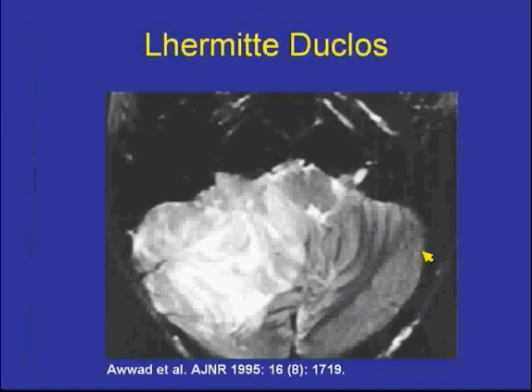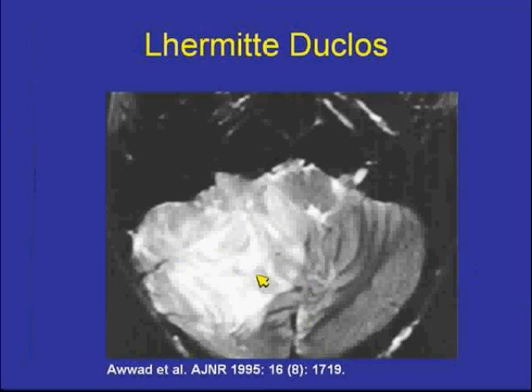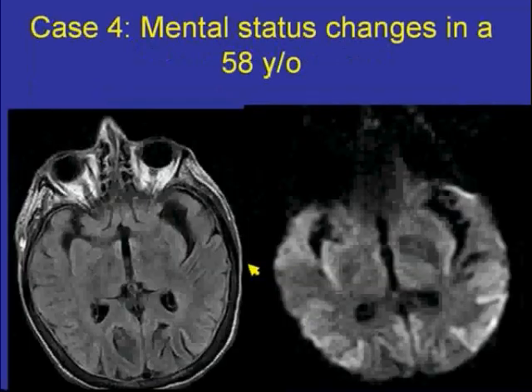The other foil was Lermitte-Duclos, which is a lesion usually of a cerebellar hemisphere, considered a type of ganglioglioma. We now move to the next case, which is a patient who had mental status changes.